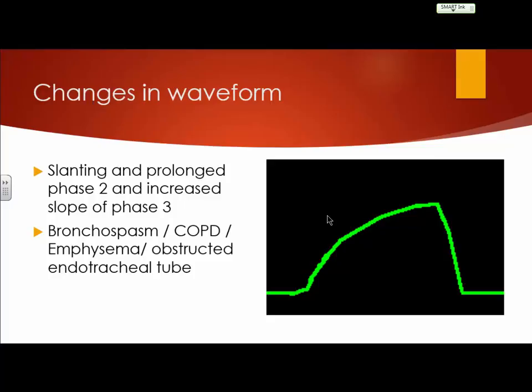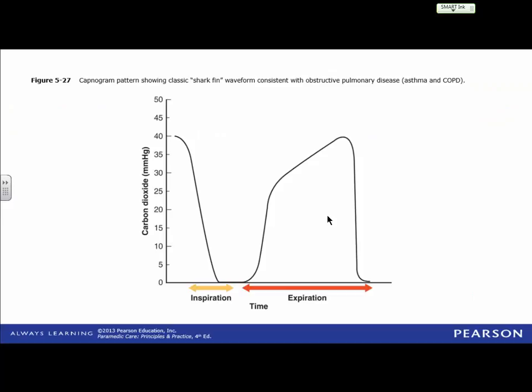All right? So what falls under this? Obstruction or spasm. Bronchospasm, COPD, things like that. Okay? Make sense?